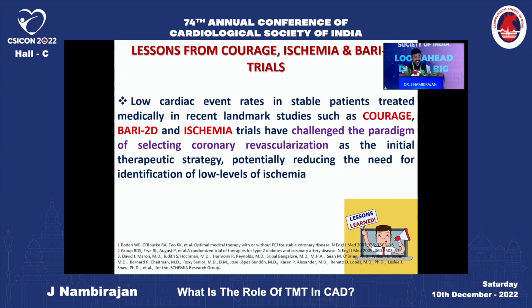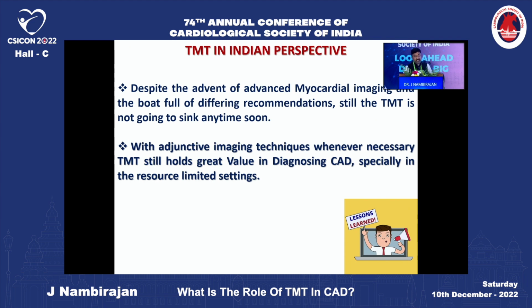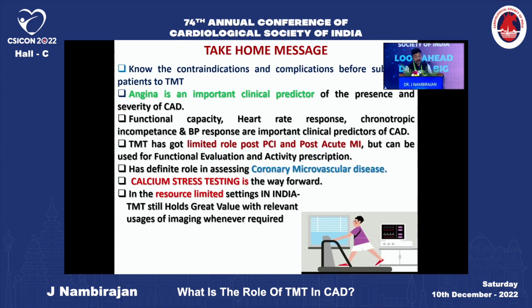So lessons from the COURAGE, ISCHEMIA and other trials say that both medical therapy and revascularization hold good as a similar thing. So there is no need for identification of low levels of ischemia. Despite the advent of imaging and other recommendations, TMT is still not going to sink anytime soon. With adjunctive imaging techniques whenever necessary, TMT still holds great value in diagnosing CAD, especially in resource-limited settings like our country. So, finally, the take-home message: you should know the contraindications and the complications before subjecting a patient to it.